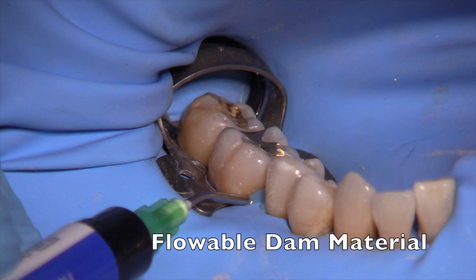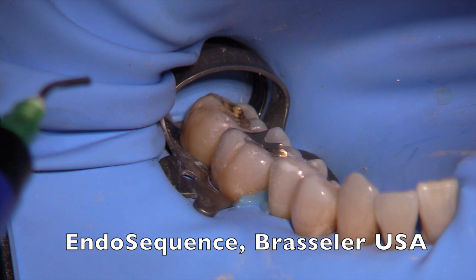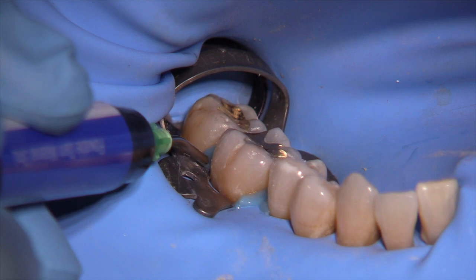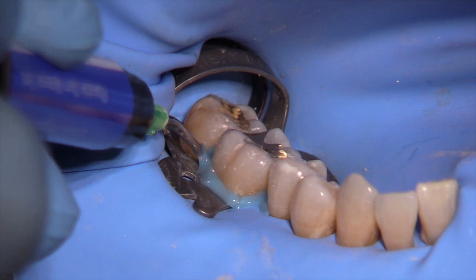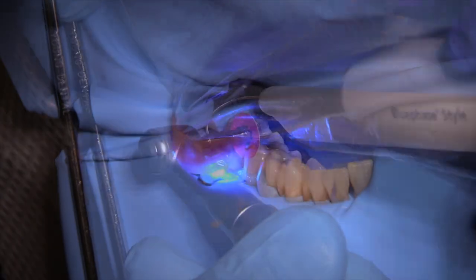Now we're going to prepare the Class I buccal pit gold foil on tooth number 30. After we condense that, we're going to finish and polish the entire quadrant. Even though we have nice isolation with the rubber dam, I like to place a 27 clamp on the tooth I'm working on, then use this flowable product by Brasseler to seal the edges and make sure not even the slightest drop of moisture seeps through — which, as we know in gold foils, is disastrous.